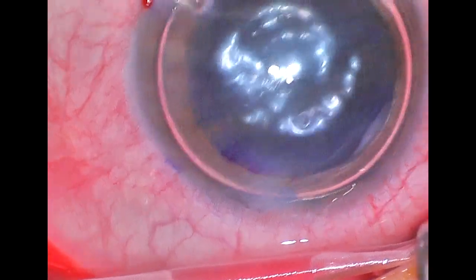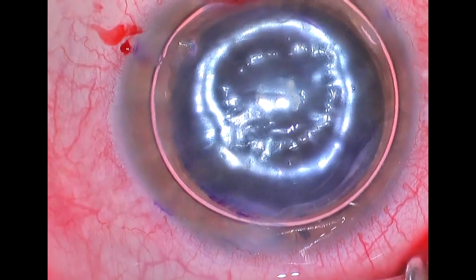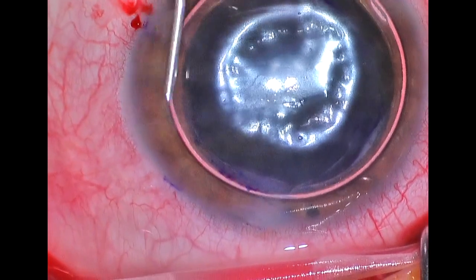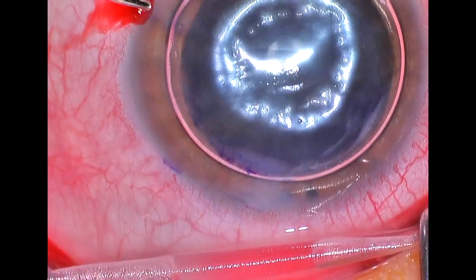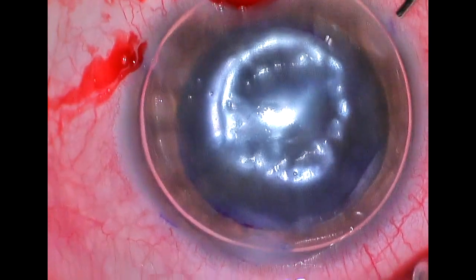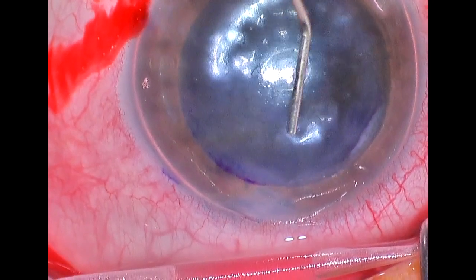Now that the graft is positioned, we can inflate the eye completely — close to 100% — with air. We want to get as much air as possible in the anterior chamber, but we want to keep the eye at a somewhat physiologic pressure because we don't want to stop blood flow to the optic nerve due to too much pressure inside the eye. We've got our new graft in blue, centered very well over the pupil, and we're working on achieving the appropriate physiologic pressure.